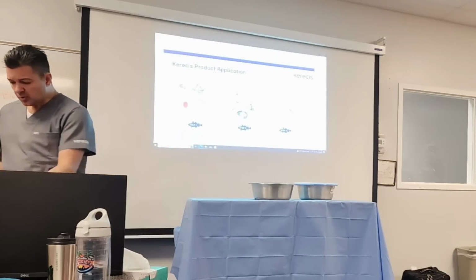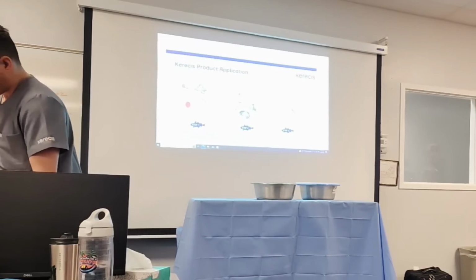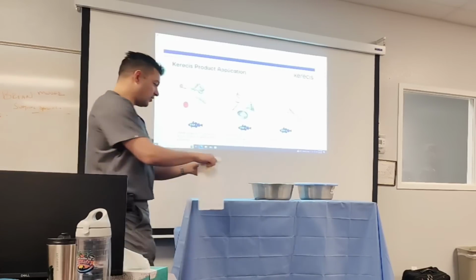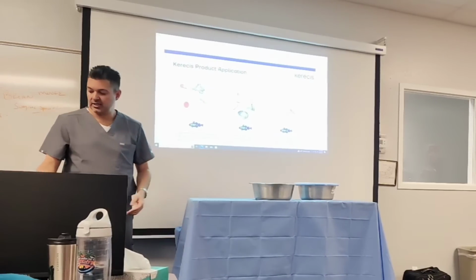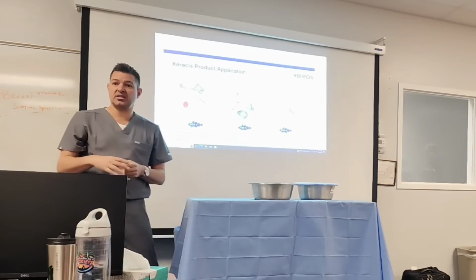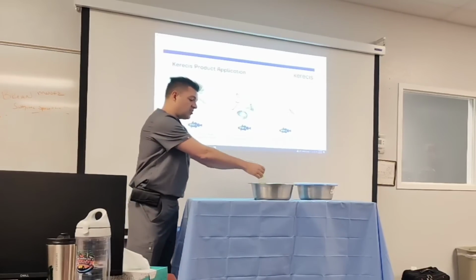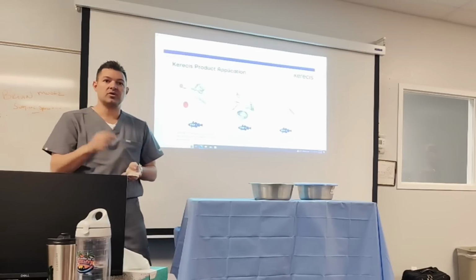So we have this on display here. After we open the first piece, the second piece will be inside here. The circulating nurse will provide it to the tech, and then the tech will put it into room temperature saline, not to be misconstrued with warm. It could curl up otherwise, but you just lay it in here. It's fine if it sits there for longer periods, but a minimum of 30 seconds to a minute is what we want.